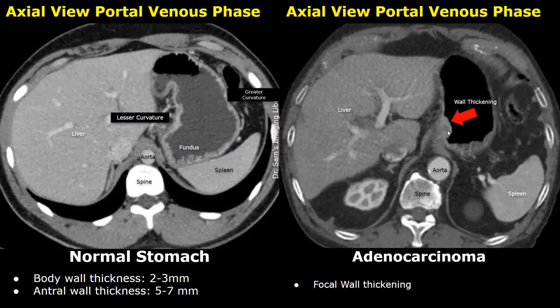Gastric adenocarcinoma is a common type of stomach cancer and its features on a CT scan can be quite varied. Increased wall thickness of the stomach can occur; the wall thickness can be focal, segmental, or diffuse. If the wall thickness is greater than three millimeters in the body, it suggests pathology. In this case there is a focal wall thickening which raised suspicion for adenocarcinoma, and after further investigation it was found to be early stage adenocarcinoma.